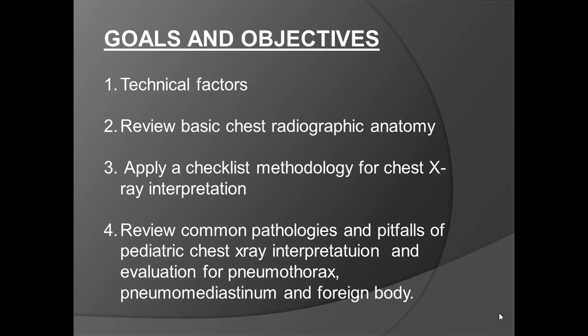Factors before dealing with the interpretation. We review some basic radiographic anatomy later. Then we apply a systematic approach for the interpretation. And finally, we review some pediatric emergencies as well as the common routine pathologies.